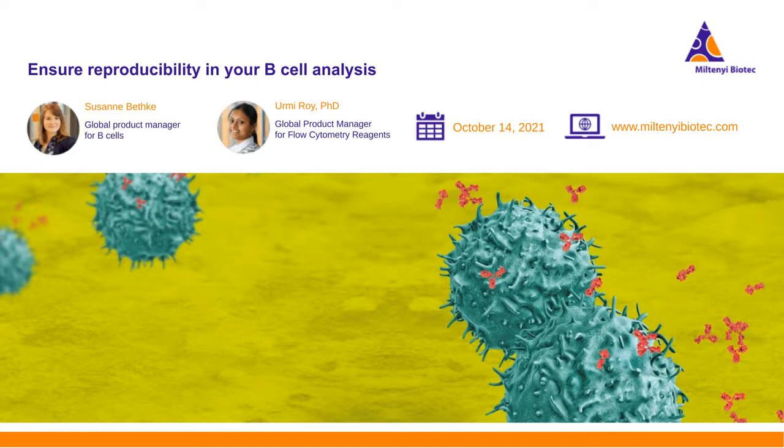Okay, that's probably a good question for me from the B cell side. I mentioned quickly at the end that you can also sort these rare antigen-specific B cells, and as you don't have so many of them, it's a good idea to cultivate them. There are of course different options. We also have a very nice media kit, where you have a nice B cell medium and several supplements that you can use. For instance, IL-4 promotes B cell survival. Then also the antigen itself pushes the B cells and activates them more, and they then grow nicely. And we also have things like CpG that activates the B cells through the TLR ligand.